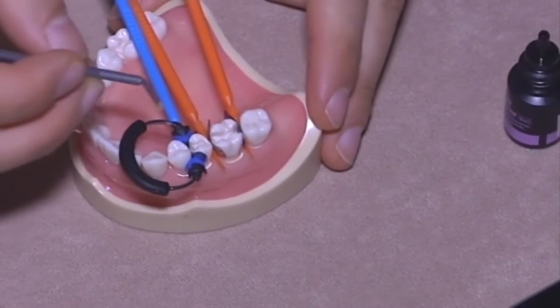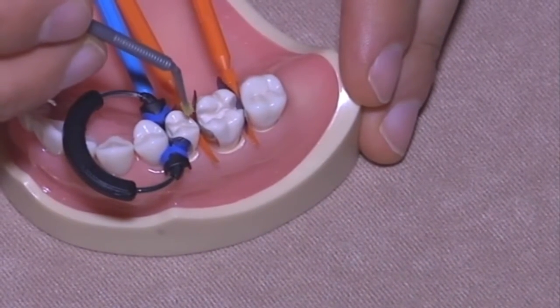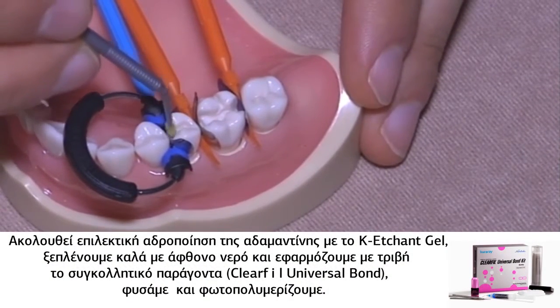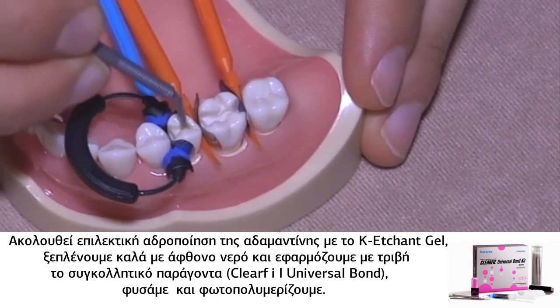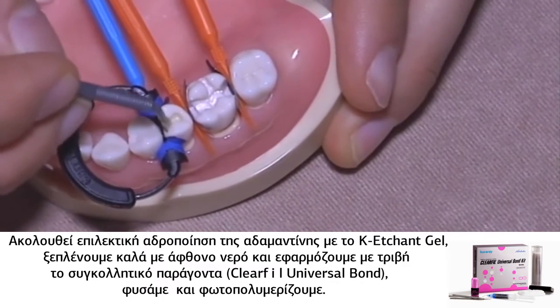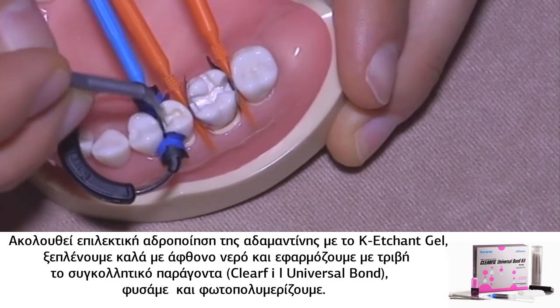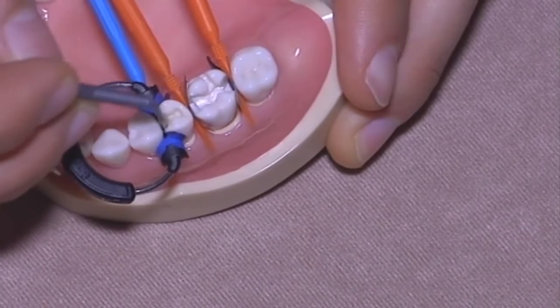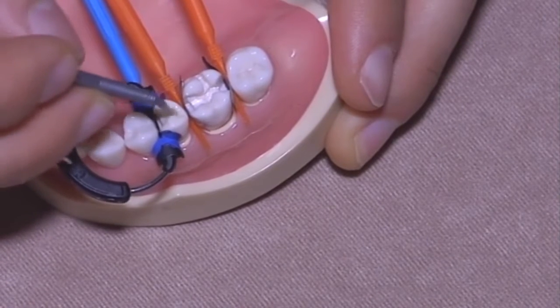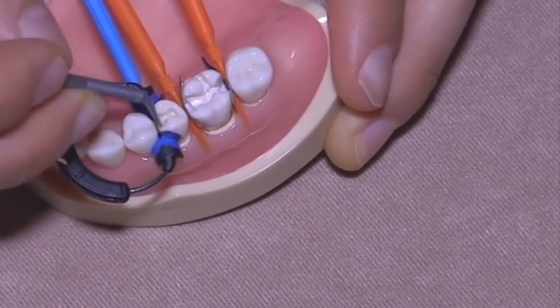Technically, in a real tooth, I would create a selective enamel etching. We don't have enamel here, but selective enamel etching and then self-etch approach, because as I told you before, today the best option for dentin is the self-etch approach. It requires less operator effort, less post-op sensitivity, and is less influenced by the expertise of the dentist. The only thing you have to do is to brush, brush, brush, brush.